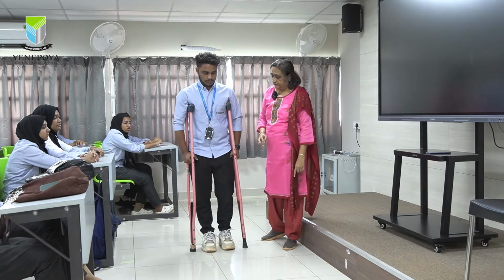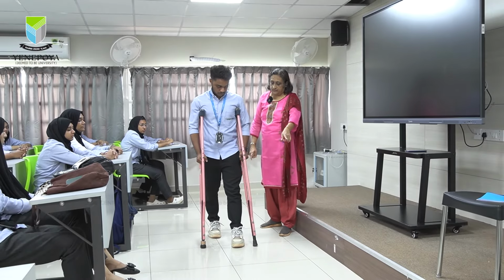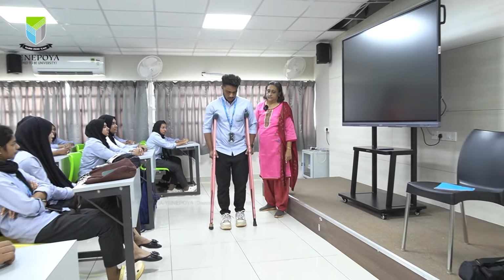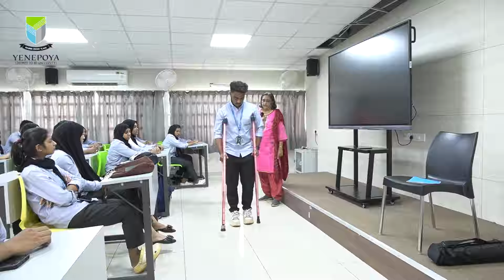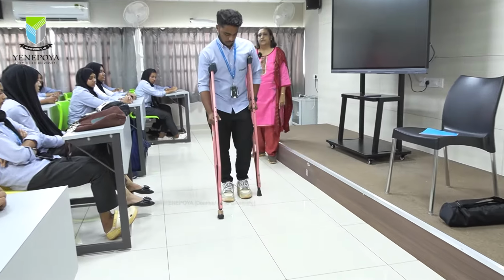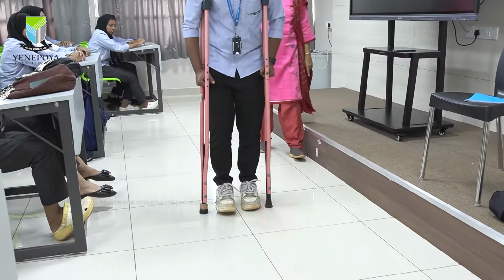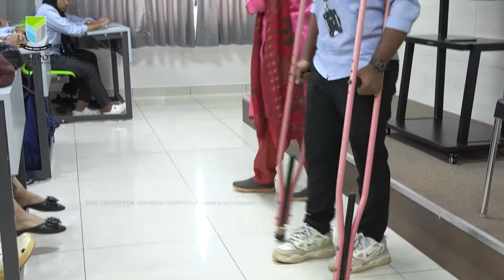So whenever you are training the person, always tell the person to take one crutch first, then the opposite leg, that is the second point, then the third point and then the fourth. Again 1, 2, 3, 4. Thank you. Wait over here. Okay, so this is the 4-point gait. Has everybody understood? Yes. Okay.